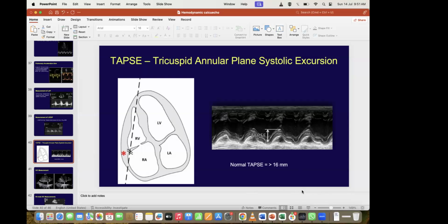Sanjeevani, do you want to say anything on this? No, MAPSE is correct. No issue about it. Actually, for LV dysfunction, MAPSE, MR dP/dt, then your LVOT-VTI, all these are very important in addition to EF and, of course, strain nowadays.